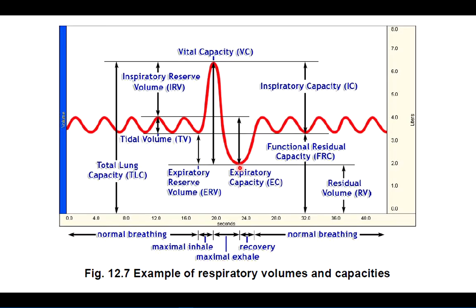Now, sometimes a person gets to the end of the exhale and thinks that they've gotten all of their air out, when in reality, because of that small difference in pressure, air is still moving out of the lungs. So it may take 2 or 3 seconds of this maximal exhale to fully ensure that all the air gets out of the lungs. So that exhale, where it's very forceful at the beginning, during this first second of time, we get most of the air out. During the second second, we're getting a little bit more air out, and then during the final third second, we're ensuring that we've got all the air out. So at this point, the participant resumes normal breathing. We go back to this normal sweeping tidal volume that you see here.